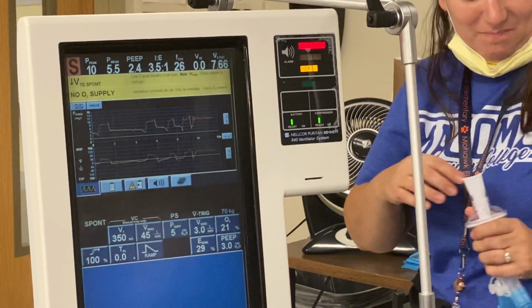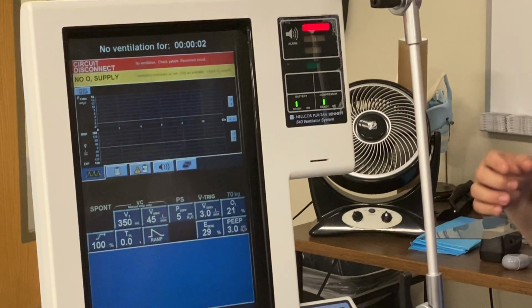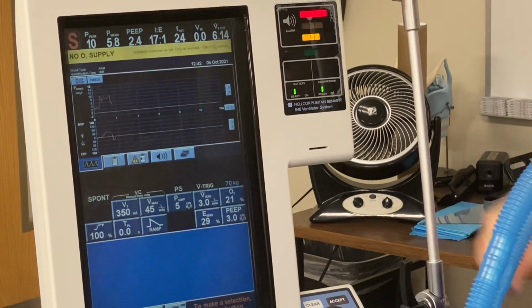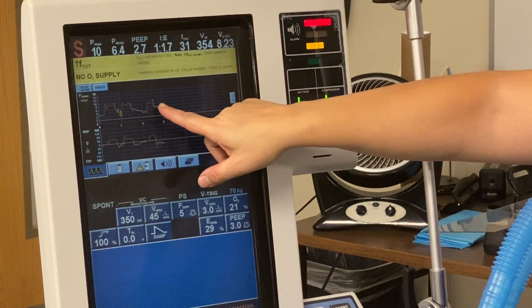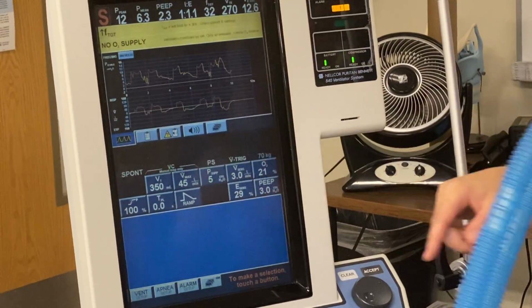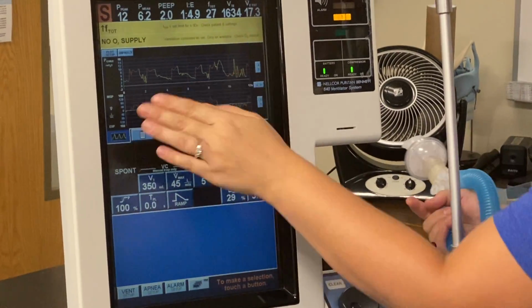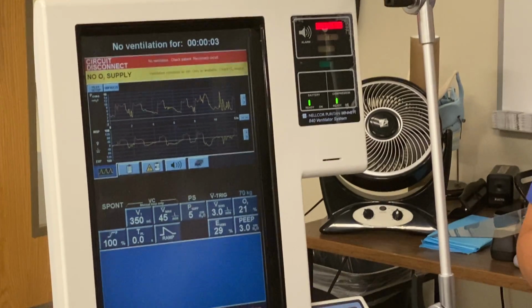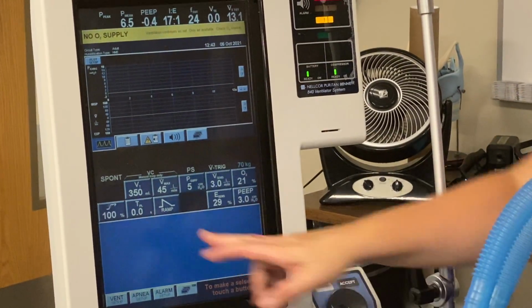That was too much. That was too much. You guys see it? Yeah, that's indicating it's too much, right? That's why this is so wacky. But that spike, it's telling you it's too fast. So you would just keep lowering it until it's a straight line?